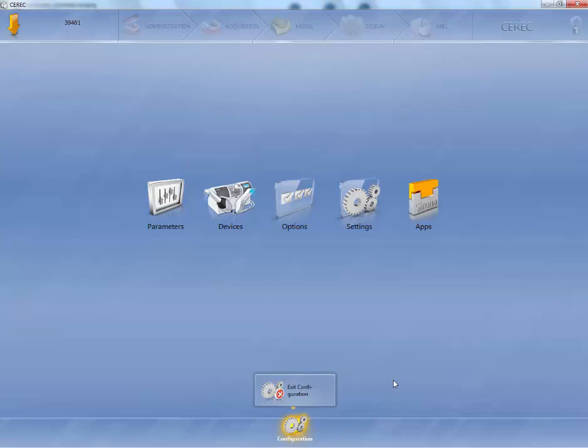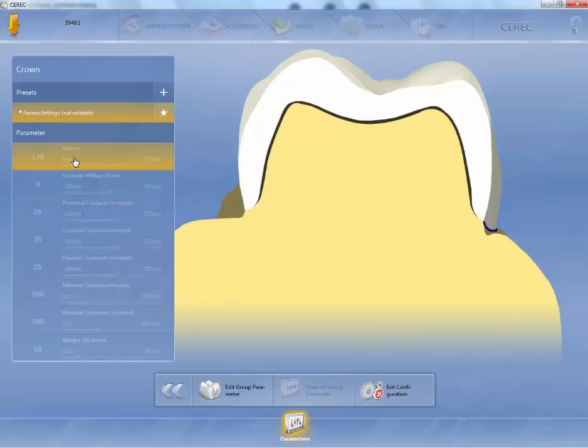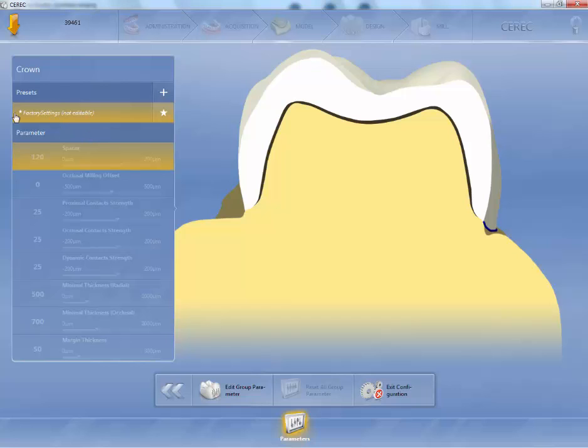I'd now like to discuss the parameters and how we're going to set your machines up. So we're going to click the parameter setting. If I go across, I'm going to start off with the crown first. I'm going to double click on the crown, and as you can see, we have no presets as factory settings which we cannot edit.